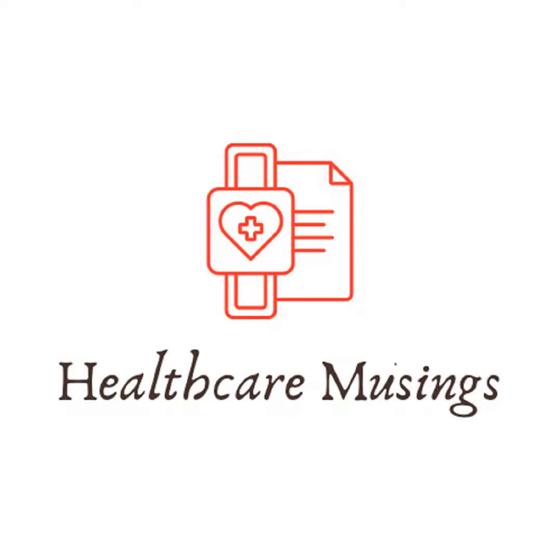Or they used to. I don't know, they've changed, but if you put somebody on SIMV in the operating room when somebody's under general anesthesia, it is the same as assist control. There's no spontaneous breathing. They're only getting what you dial for them because they're paralyzed and generally anesthetized. But once they wake up and they start breathing over the respiratory rate you set, they're going to get whatever pressure support you dial, and it increases their work of breathing.